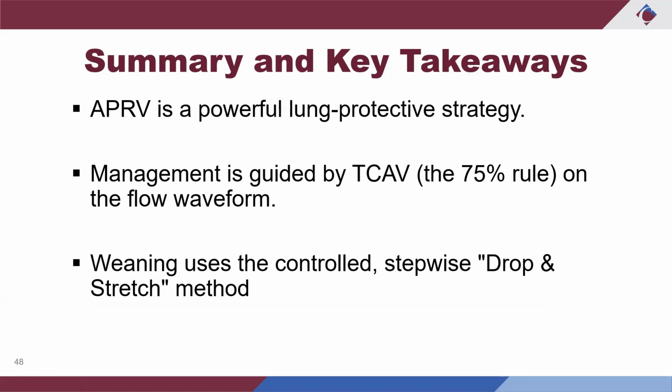So with all that, thank you for hanging in there and sticking with me. As my summary, it is a powerful lung protective strategy mode. Hopefully tonight I was able to demonstrate to you that it is lung protective and it is safe. Again, it's all in the hands of the clinician who's setting it up. So that's the purpose of these classes. If you're not sure, always ask if you get an order to set one up. We've got plenty of experienced staff at both facilities that have used these modes, again, managed by the guided TCAV.